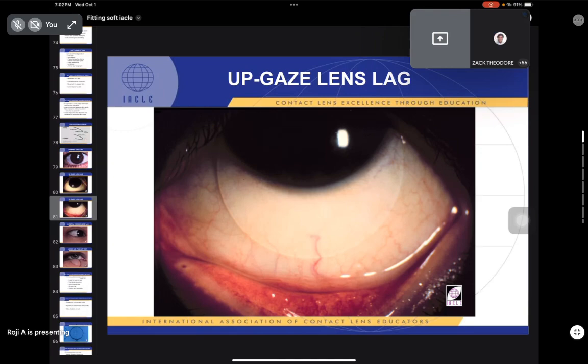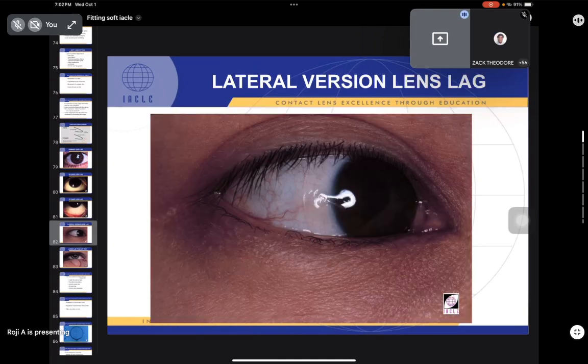Yes, Doc. Okay, gotcha. And then this is lateral lag. Is this acceptable or not? Parang hindi po, Doc. Correct. Why? Because it looks more than 1.5. Correct. This is beyond 1.5. So that's how you assess. Very good, Zach. You see it right away. This is beyond 1.5. So basically, this is how you would assess.